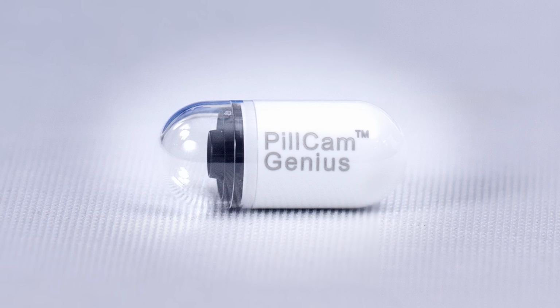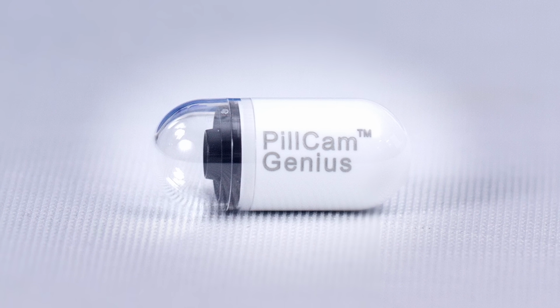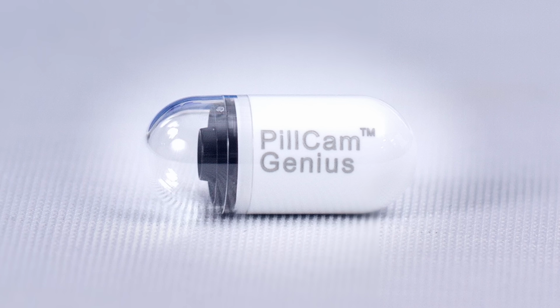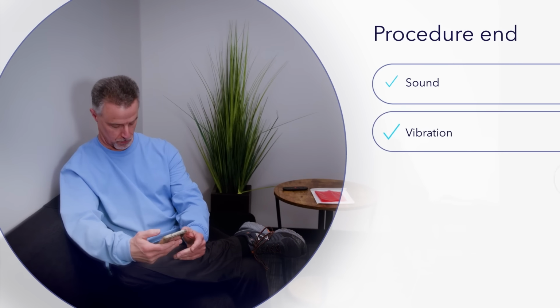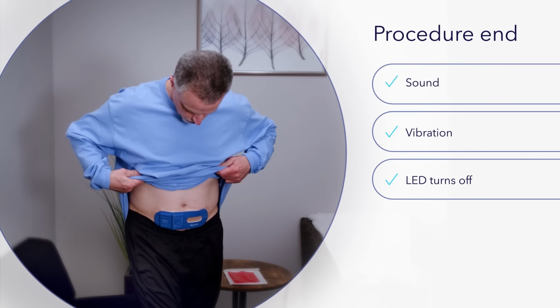The procedure is complete when the capsule has either exited the body or its battery life is exhausted. At this point, the PillCam Genius Link device can be removed from the patient's abdomen. When the procedure ends, the patient will hear a sound, feel a vibration, and the green LED on the Link device will turn off.